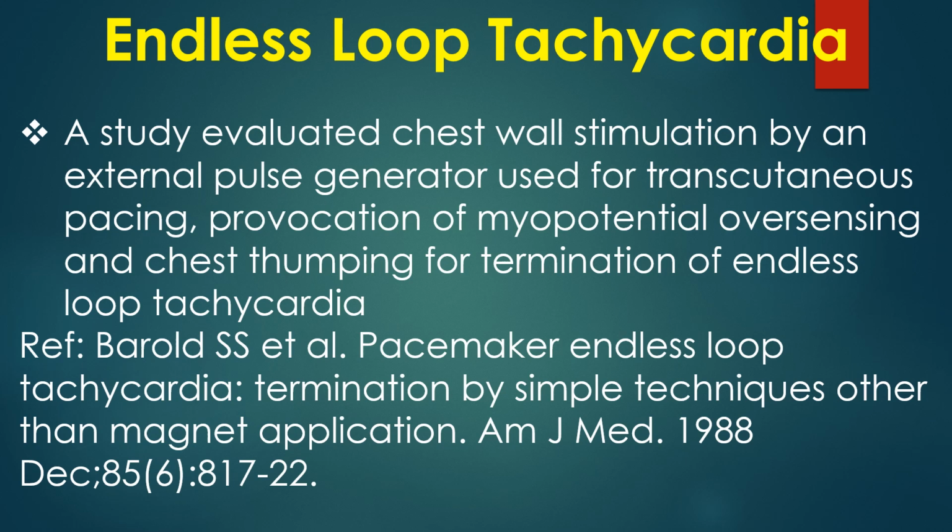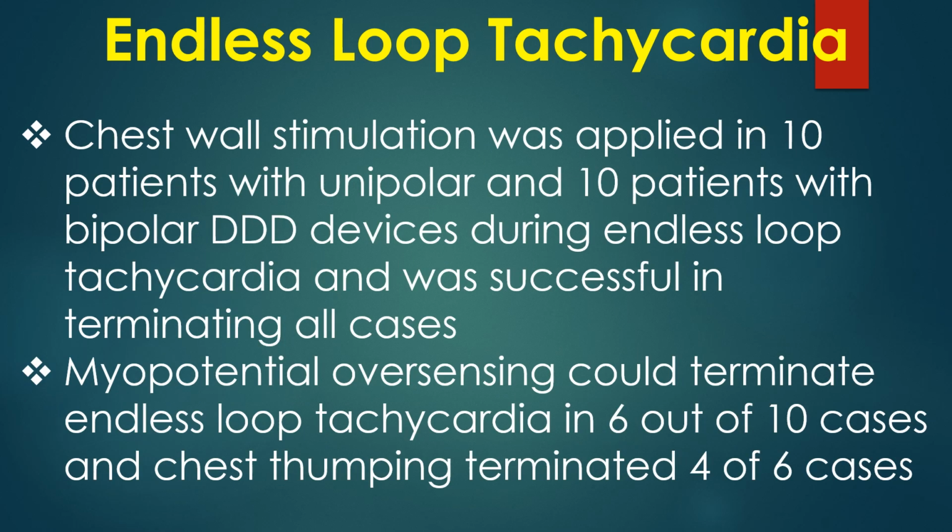A study evaluated chest wall stimulation by an external pulse generator used for transcutaneous pacing, provocation of myopotential oversensing, and chest thumping for termination of endless loop tachycardia. Chest wall stimulation was applied in 10 patients with unipolar and 10 patients with bipolar DDD devices during endless loop tachycardia and was successful in terminating all cases.